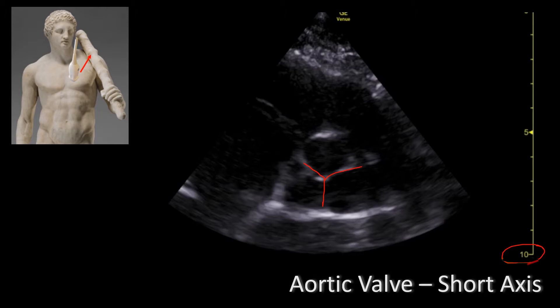Let's talk about the cusps of the aortic valve. The aortic valve cusp that is closer to the interatrial septum is going to be the non-coronary cusp. The cusp that is closer to the right ventricle is going to be the right coronary cusp. And the third cusp that's left is going to be the left coronary cusp.